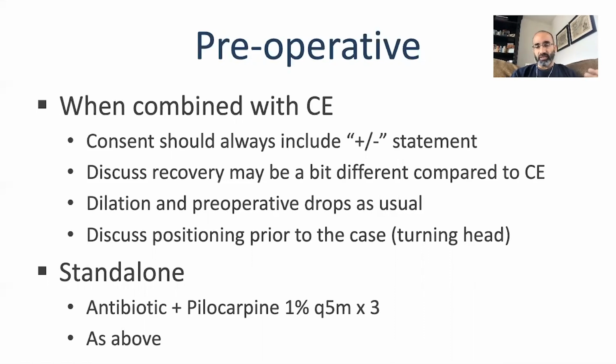This is one of my favorite things to talk about when new surgeons or surgeons who are new to angle surgery are attending some of these lectures. You should always talk to the patient before going to the operating room about turning their head, turning the microscope, just so they're prepared for that repositioning that happens after cataract surgery. The reason for this is the patient often will hear the commotion happening in the operating room when making this change in position. So it's good for them to have an idea of what's going on.